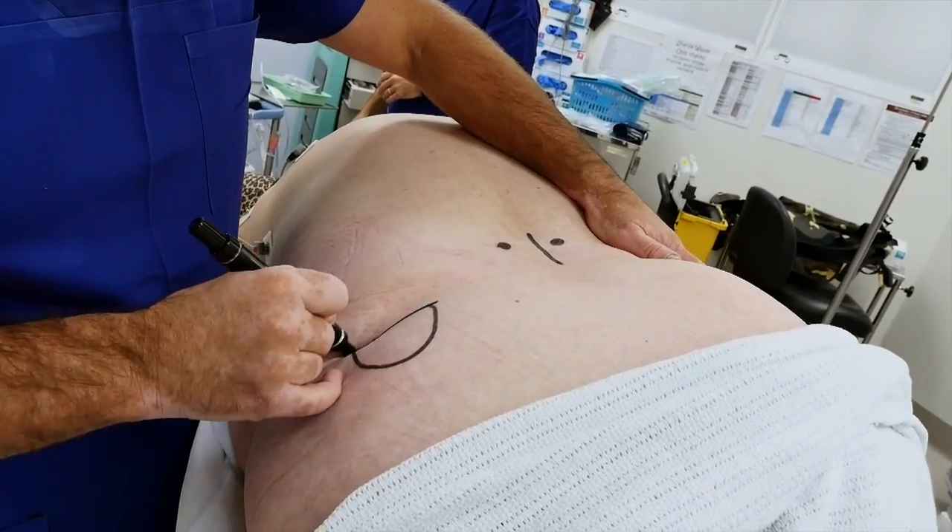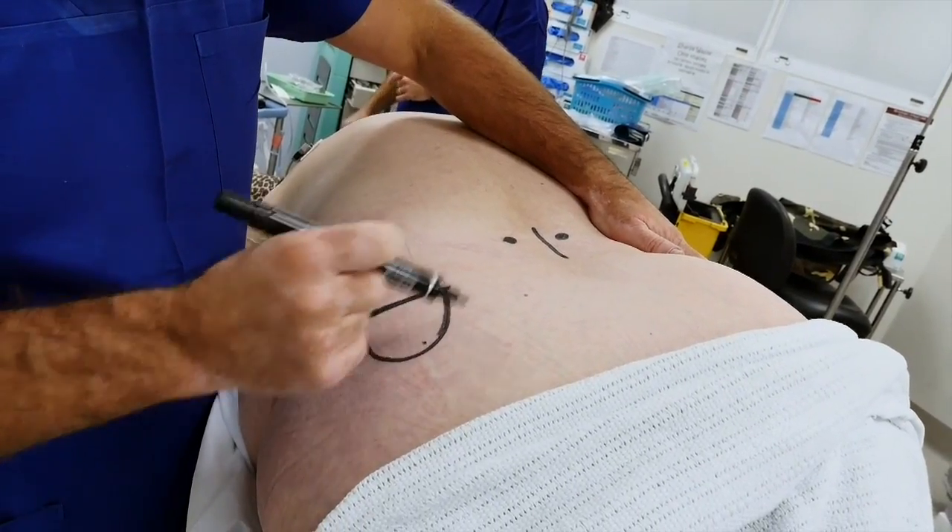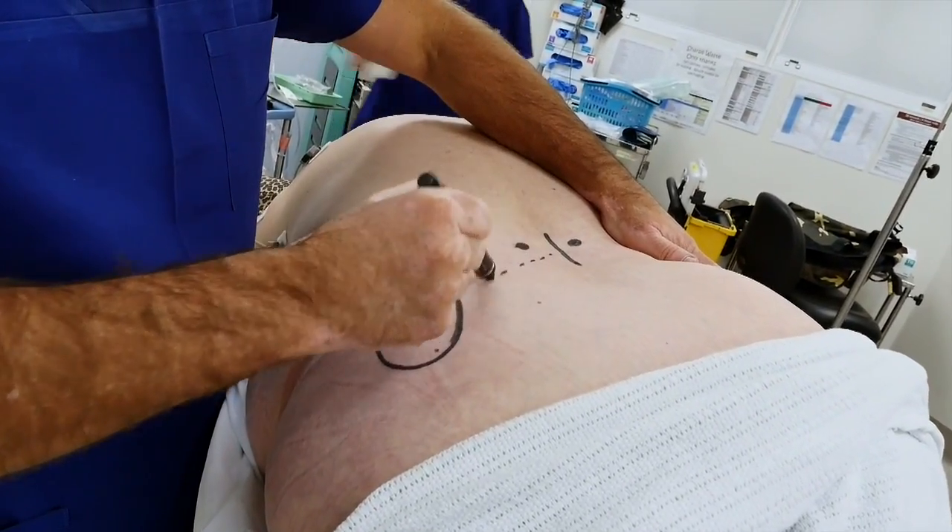The IPG will sit like this, and then we'll tunnel across here.